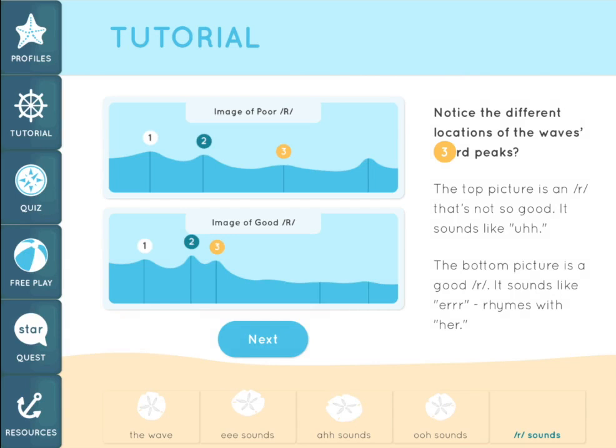Look at these two pictures and notice the different location of the wave's third peak in each picture. The top picture is an R sound that's not so good — it sounds like "uhh." The bottom picture is a good R sound.